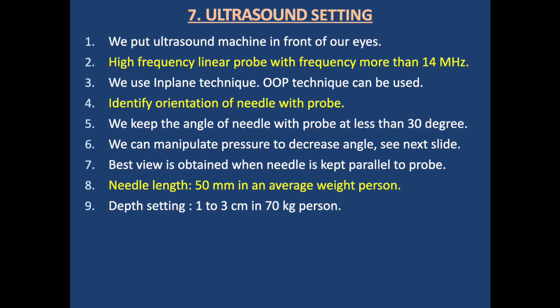Ultrasound setting. We put the ultrasound machine in front of our eyes. We use a high frequency linear probe with frequency more than 14 megahertz. We use in plane technique. Out of plane technique can be used. We identify orientation of needle with the probe. We keep the angle of needle with probe at least less than 30 degrees for better visualization.